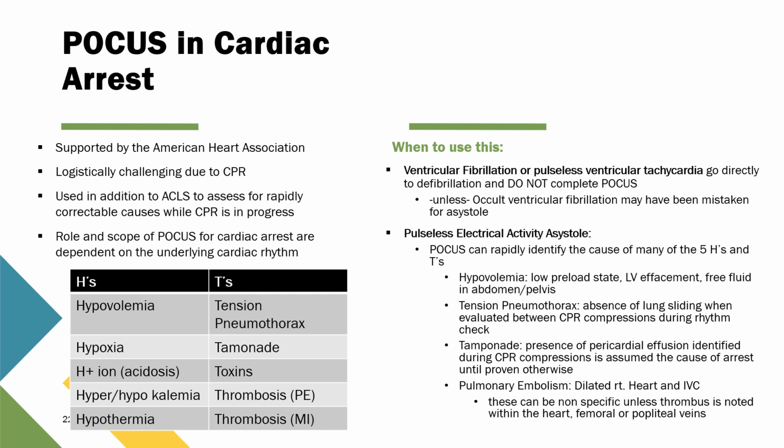So point-of-care ultrasound in cardiac arrest is now supported by the American Heart Association. It causes logistic challenges due to ongoing CPR. So the larger your equipment is, the more people in the room, the more challenging this can be. It's recommended this is used in addition to ACLS to assess for rapidly correctable causes while CPR is in progress.